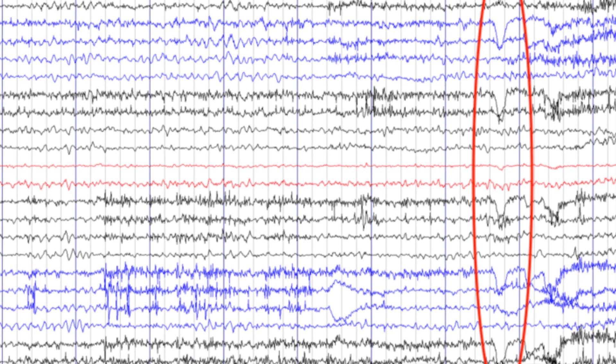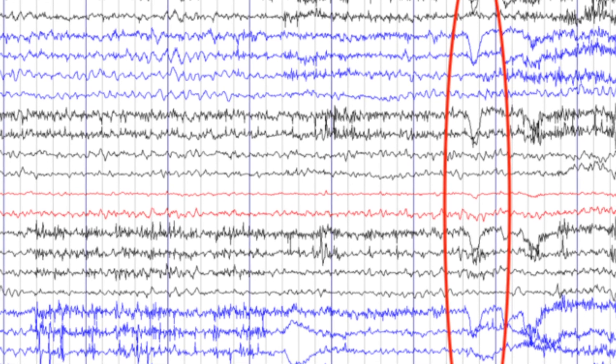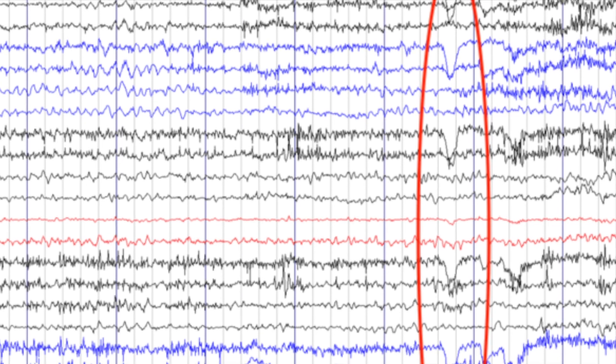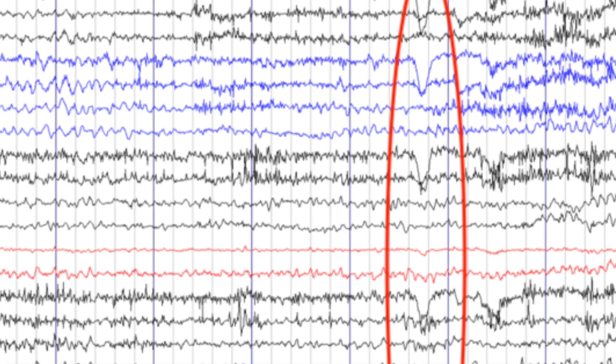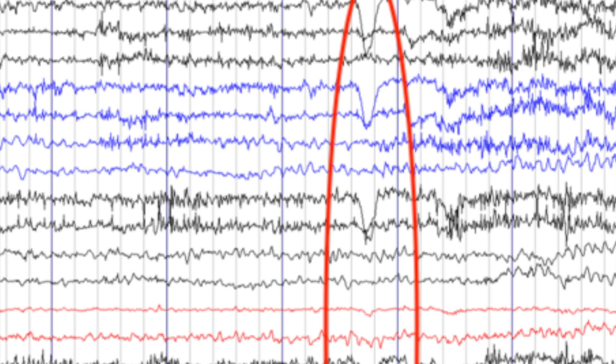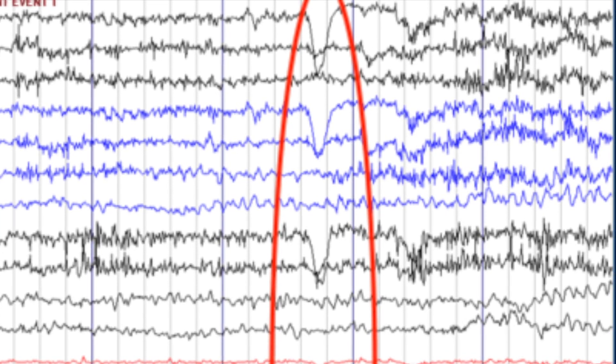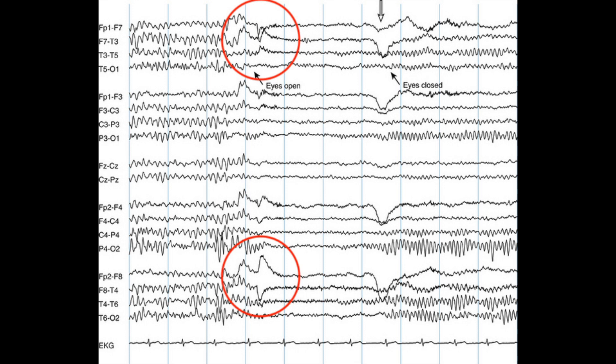After reviewing the montages and background waves, it is time to look for any outstanding waves. The most common outstanding waves are the blink responses, seen as large positive waves in the frontal leads, evident as downward deflection in the EEG. Other common normal waves are horizontal eyeball movements, also evident in the frontal leads, appearing as separating waves on the side of eyeball movement and approaching waves away from the side of movement.